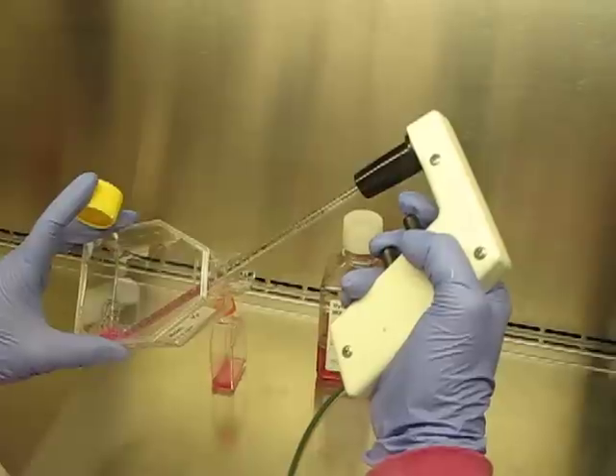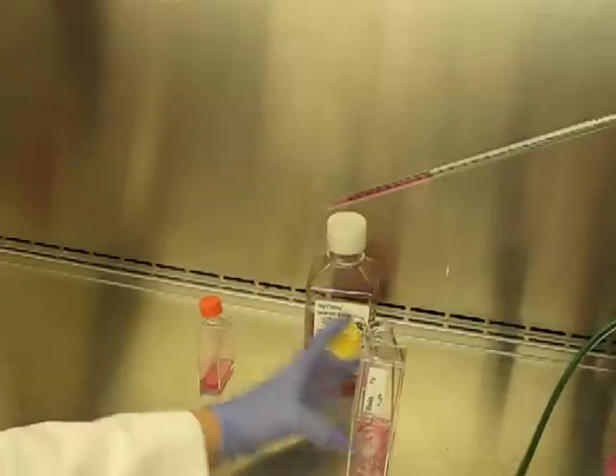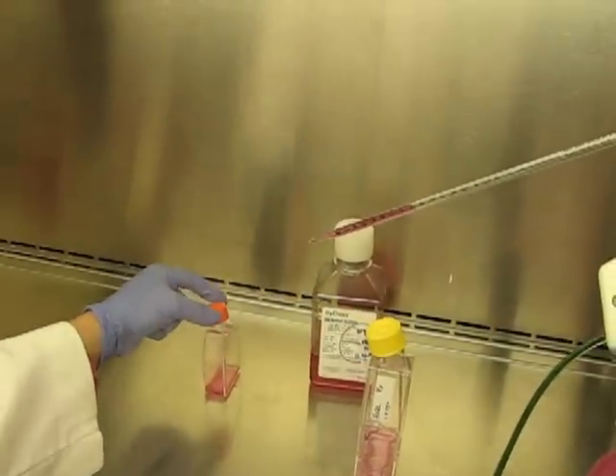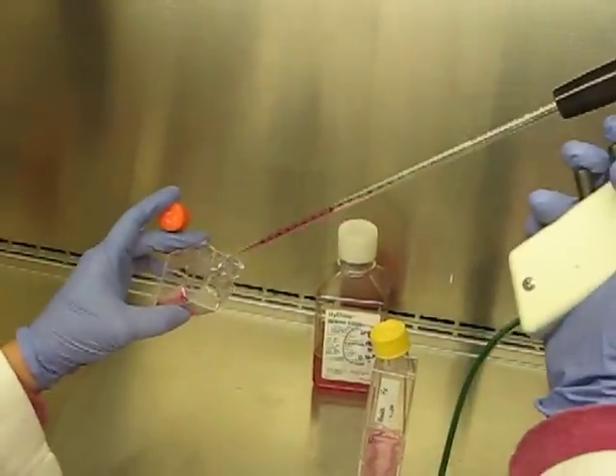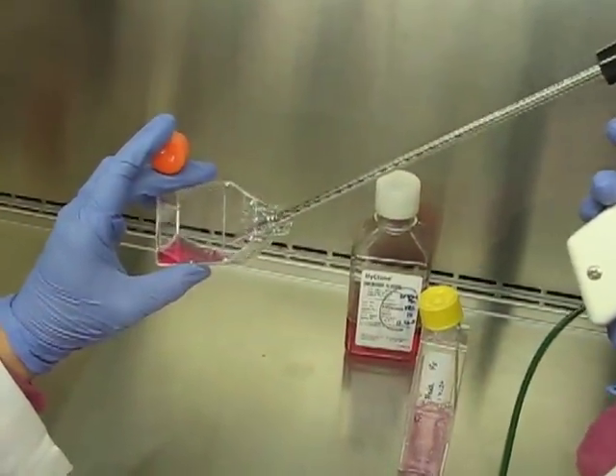Pipette up more than you need, then come down to one mil. Right into the media, expel that one mil of cell suspension.